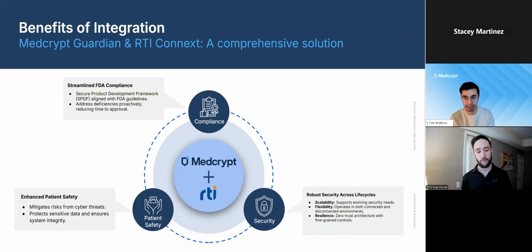And doing all this allows robust security across life cycles, both from a pre-market and post-market perspective, as well as allowing you to scale in a much easier fashion. If you take shortcuts with cybersecurity early on, it might not be a problem for your first 10 or 20 devices in the market, but it will bring an exponential set of challenges when you go to 1,000 or 10,000 or 100,000 devices, and it's much harder to fix those problems later in the life cycle.